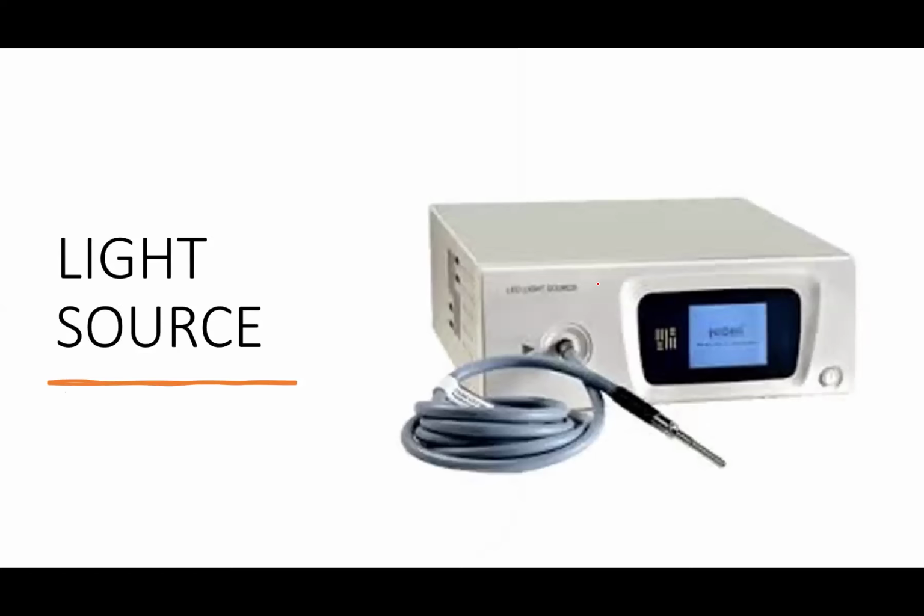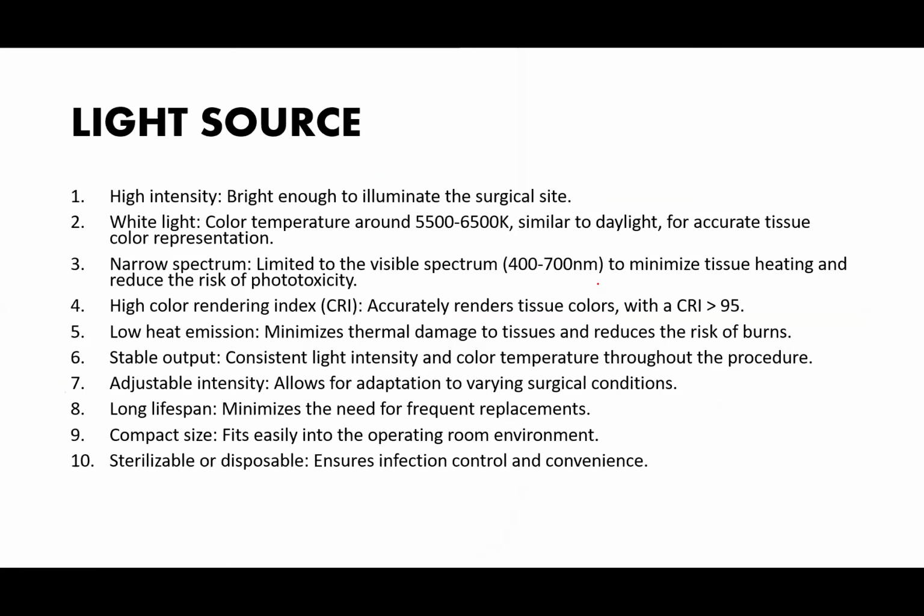Now, the next imaging system we'll talk about is the light source. The light source is a high intensity, bright enough to illuminate the surgical site. Now, the idea of the light source is to be as bright as daytime sunlight, as if you are operating in bright sunlight.